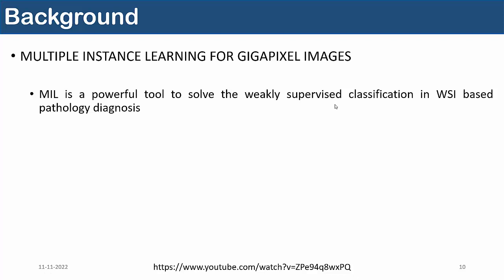And most of the time, you get images that are not annotated, and therefore the topic of my presentation is self-supervised learning. Imagine you are getting images that are not annotated, so they are very weakly supervised because you don't exactly know what areas to look for and what not. So how does this weakly supervised setup work? It's a binary system, and you have to predict whether the patch that you are dealing with has cancer cells or doesn't have cancer cells.